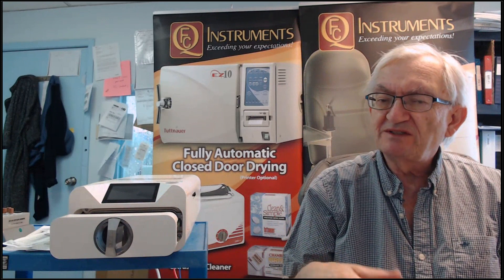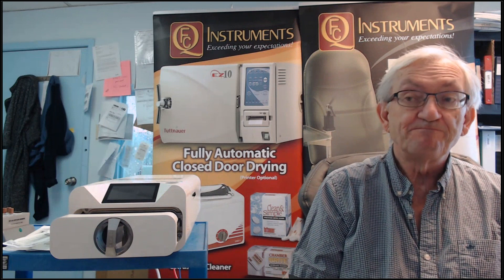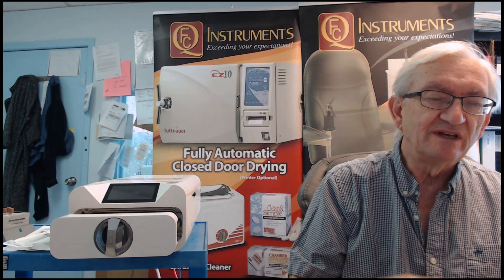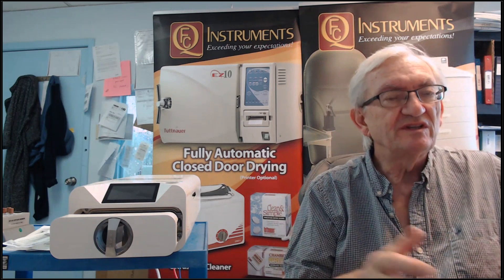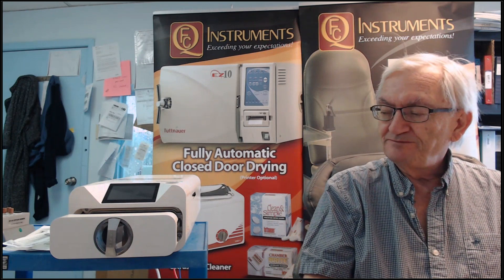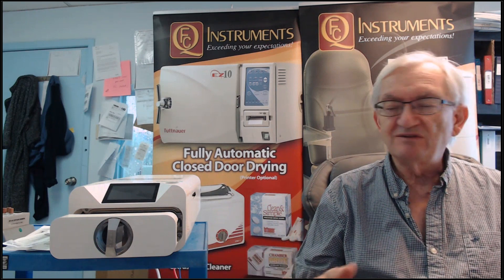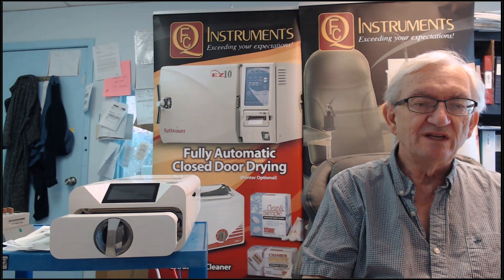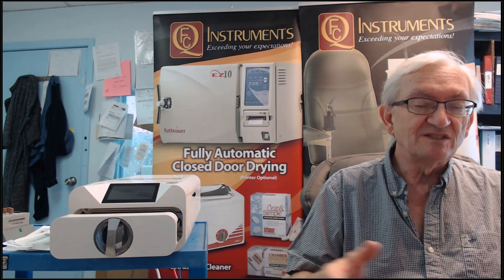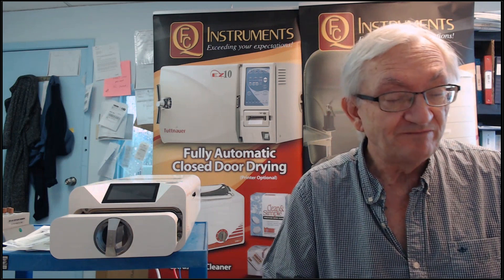This autoclave, because it's smaller, is easier to transport. One of the nice things is that dealers can have extra units in stock, which allows us to give the customer a unit they can use if their autoclave requires service. The autoclave weighs about 33 pounds — about 35 pounds shipping weight — comes beautifully packaged, and the box is small enough that you can store it in case service is ever required.